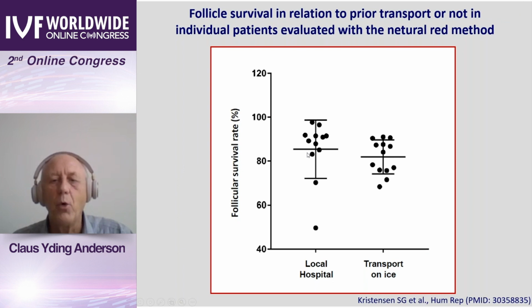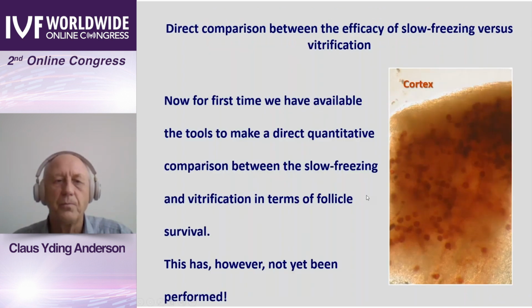So if we transport it between 4 and 5 hours, you can see that the survival is very good. There's no difference between transport and local hospital. So this is very good news for people who want to establish a centralized service. This is indeed feasible.